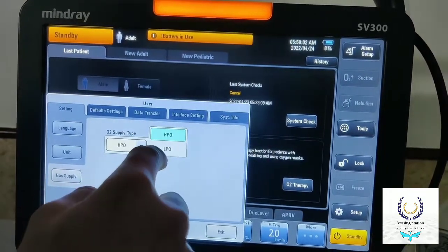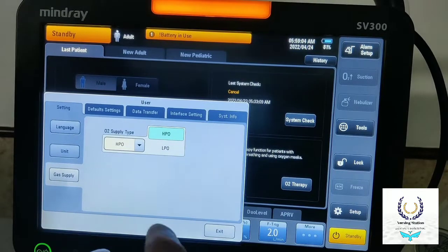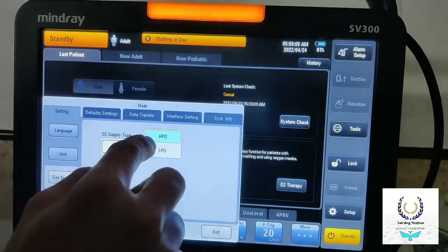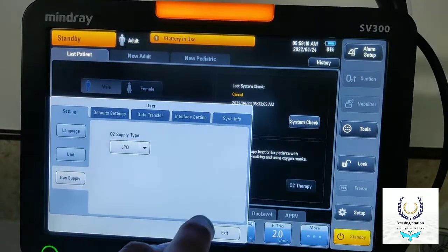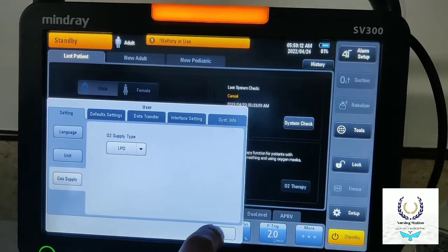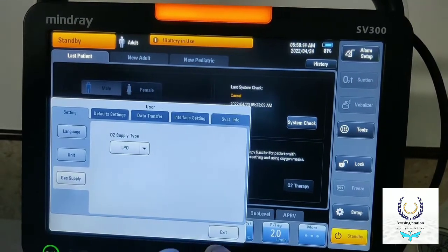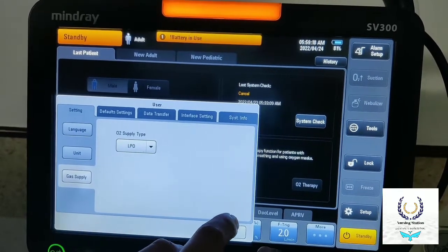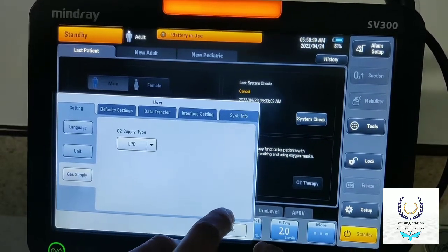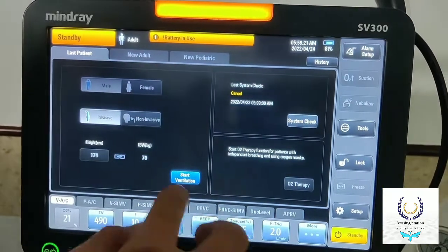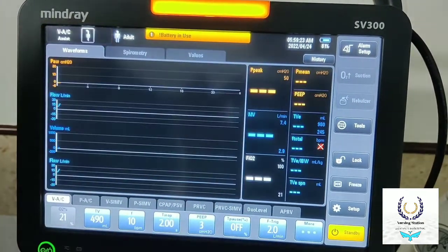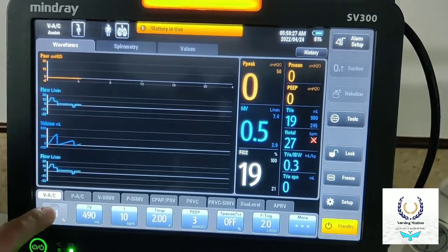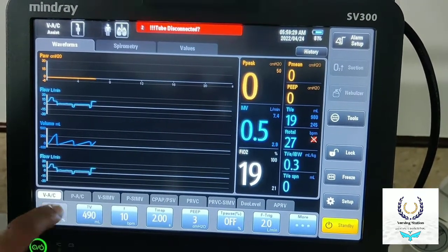Then select the Gas Supply. There are two options: HPO and LPO. HPO stands for central supply and LPO stands for cylinder supply. We have to select LPO when we are ready to use the cylinder or portable ventilator. Then go to the main screen and start ventilation.